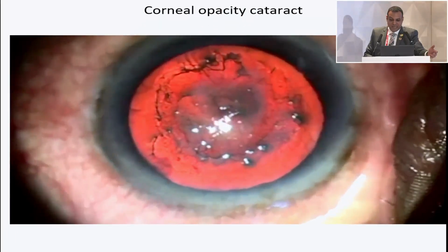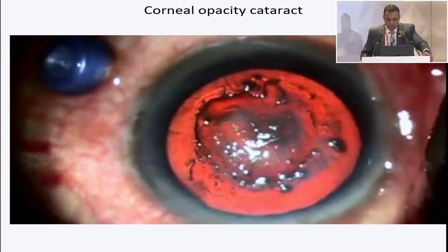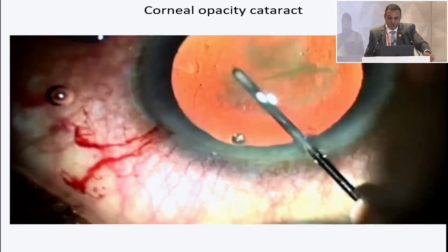Corneal opacity cataracts again can be challenging, and of course, transillumination that we all spoke about earlier has been the way that additional visualization was given, wherein you're using endo illumination from the outside, where your assistant is holding it. Another way is using a chandelier illumination, which essentially gives you an actual retro illumination, as you can see. So it's going to be a difficult scenario. Putting in a 25 gauge chandelier illumination gives you a good retro illumination.